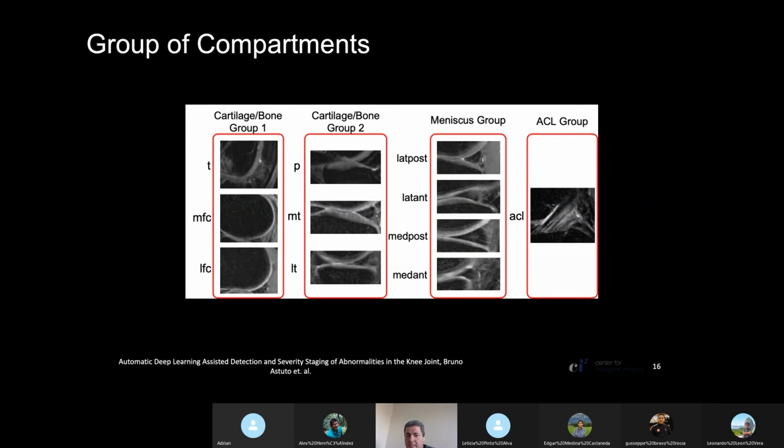This is the dataset I used to train. So at first we tried, okay, let's train a model for patella, a model for lateral tibia, a model for medial tibia. The thing is that I only had like 1,000 patellas, 1,000 tibias, and 1,000 femurs. So it's not a very large dataset. So we decided to try to combine these different structures.